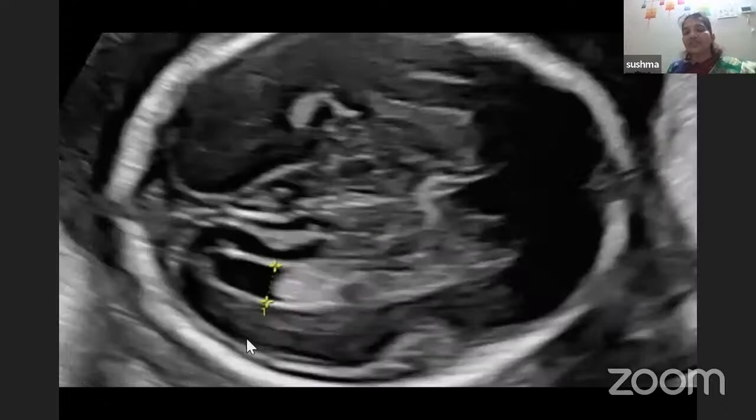This is how we measure ventricular diameter. In the fetal brain, the intracranial structures that we measure in the transthalamic plane are only BPD and head circumference. Whereas in the transventricular plane, we measure the ventricular width, also called ventricular diameter. For that, where we measure is really important. So can we measure it at this level, or at this level? In this image, you can see that it is measured between this point and this point.